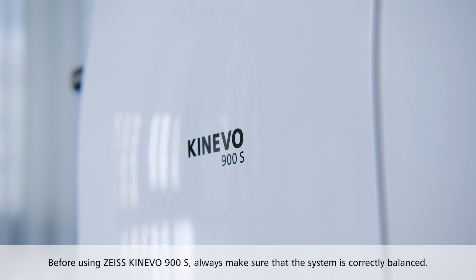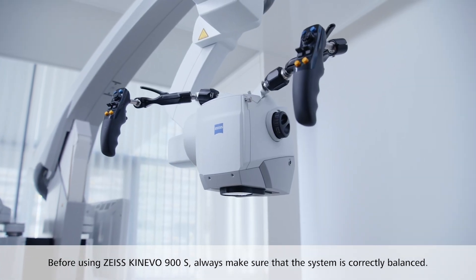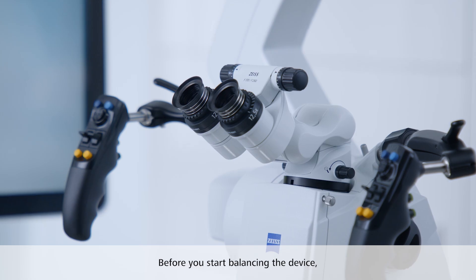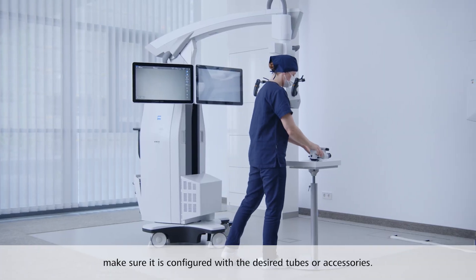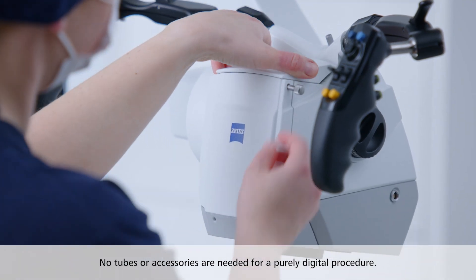Before using Zeiss Kinevo 900S, always make sure that the system is correctly balanced. Before you start balancing the device, make sure it is configured with the desired tubes or accessories. No tubes or accessories are needed for a purely digital procedure.